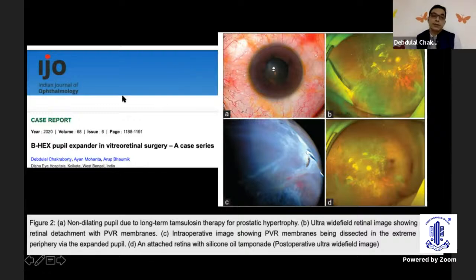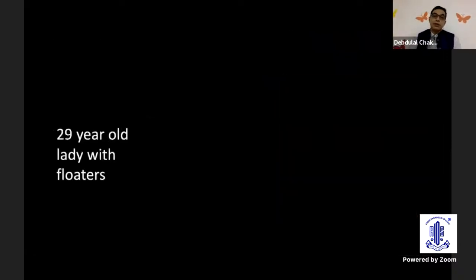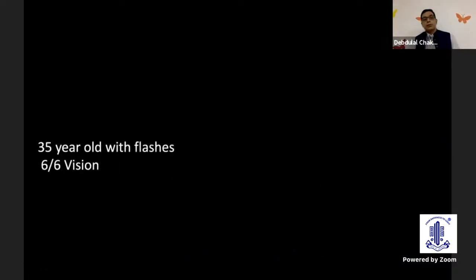So we also published this in the Indian Journal of Ophthalmology. And it's very important to actually document what's happening and what you've done to the patient. Then we have a lot of skeptics coming to us. For example, all of us have these patients, both male and females, with floaters. And you can just show them this fundus image or with the Optos and tell them that everything is OK and they need not worry. But then we have also other patients who do not believe that they have a problem.